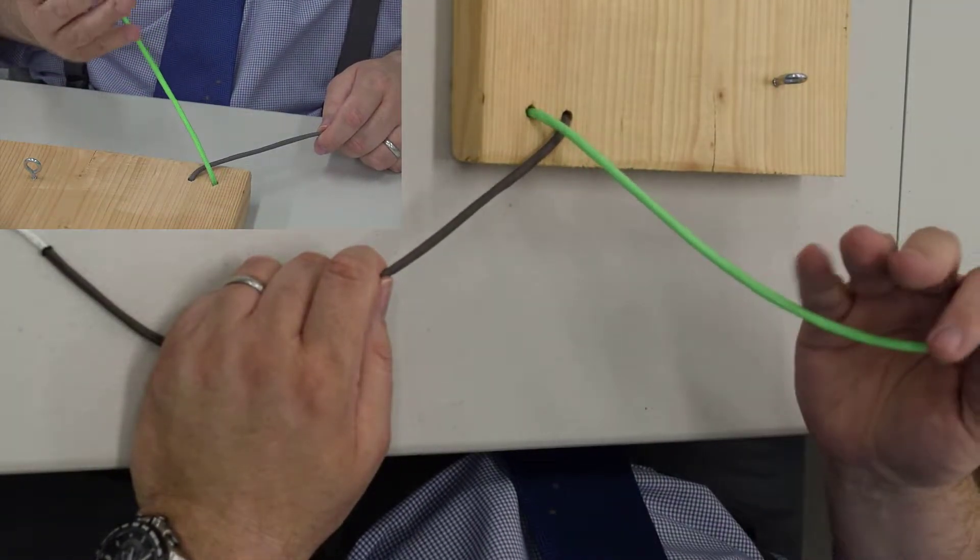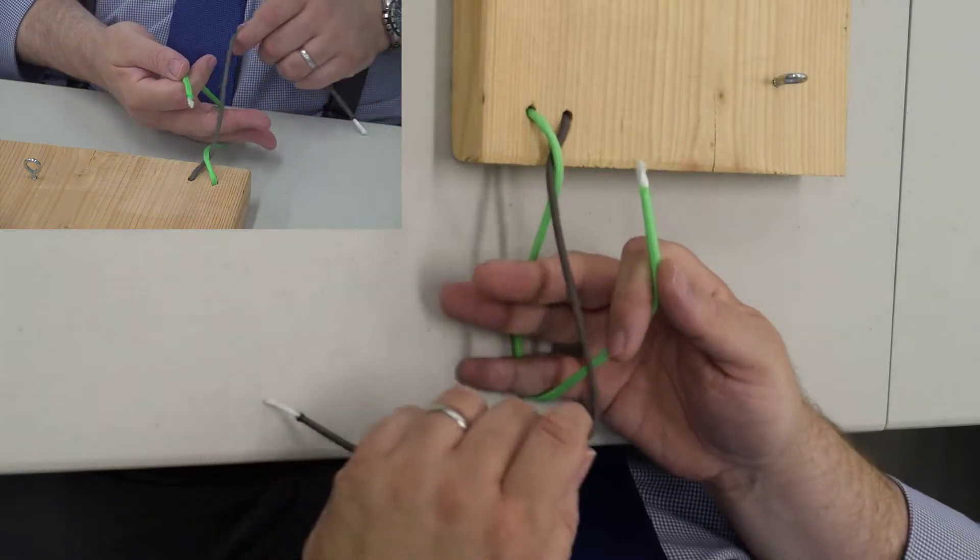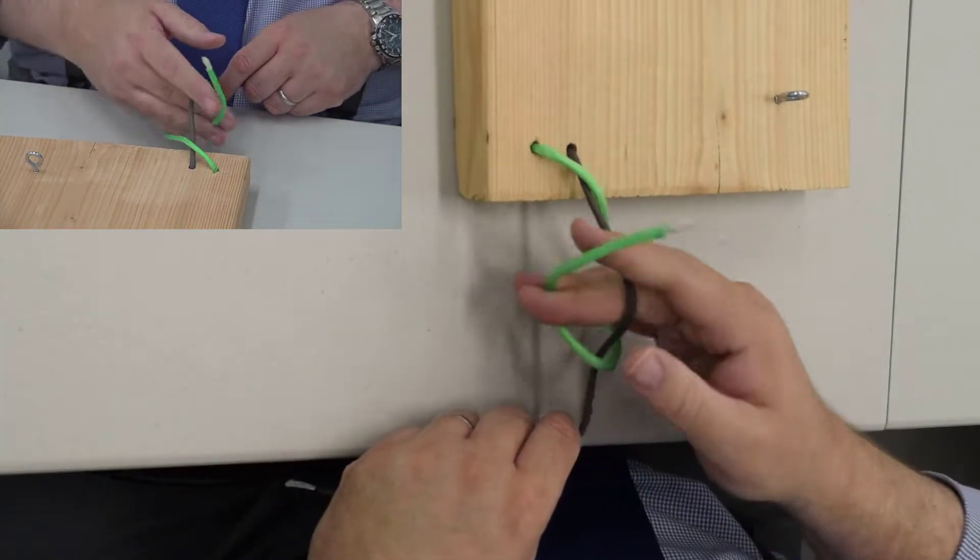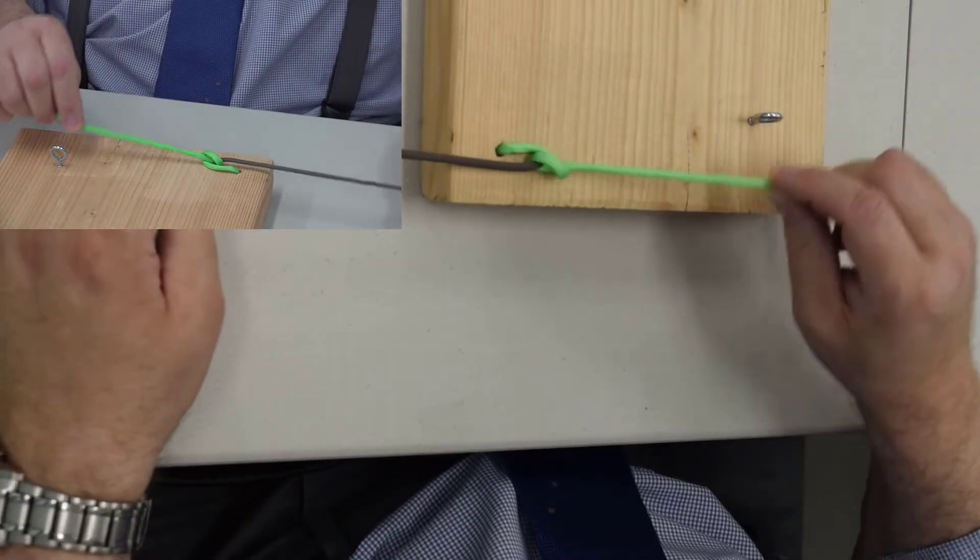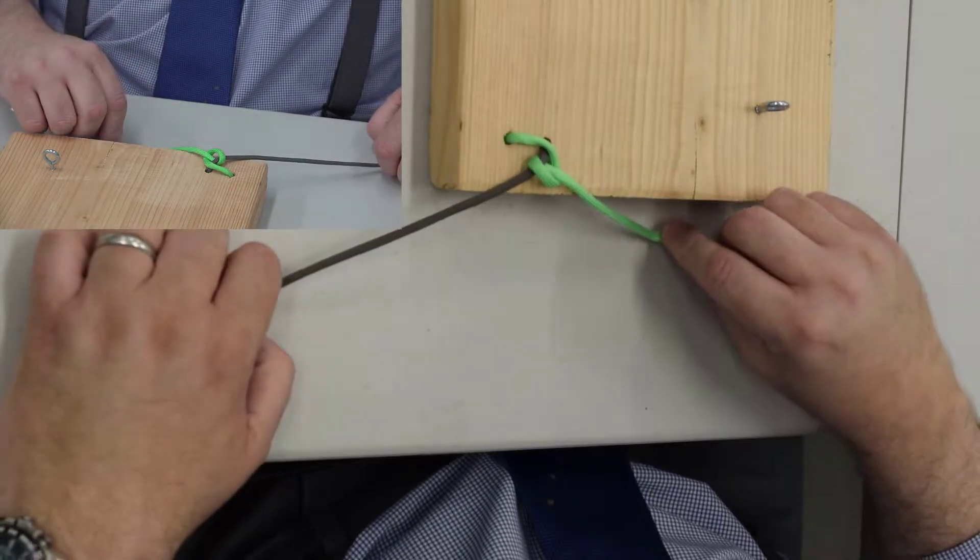I can't do the break here. If I do the break and then finish tying the break, you can see that the knot comes out kind of cattywampus. It doesn't look right. It doesn't lay flat.